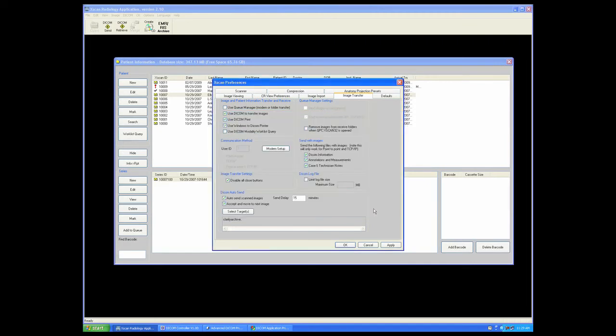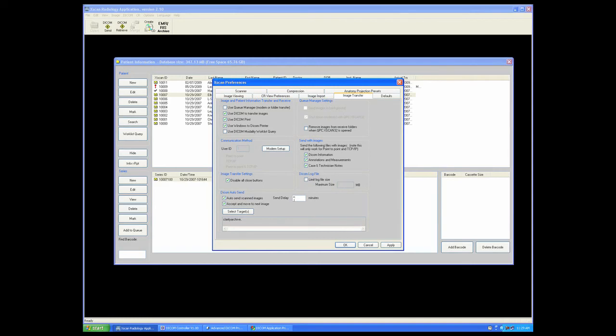Listing that target here, setting the amount of delay. Some delay is always required for an automatic send, giving the user the opportunity to cancel the send. Once that is applied.